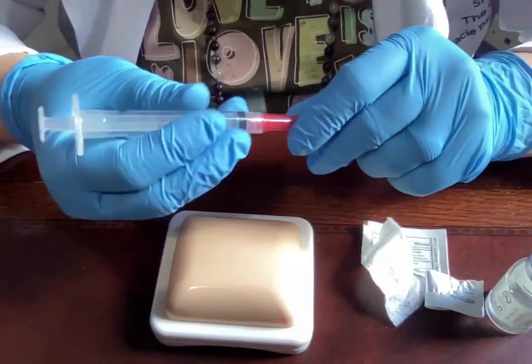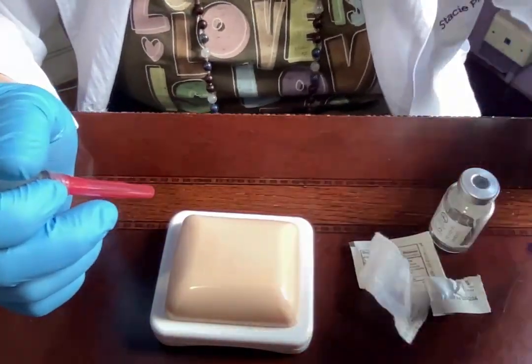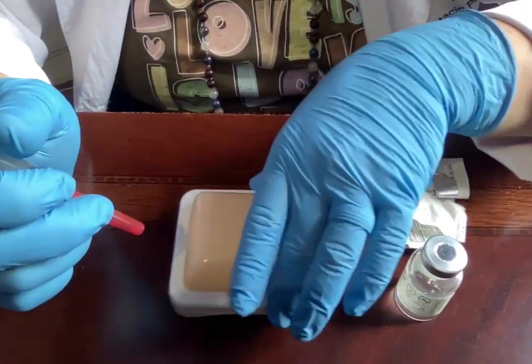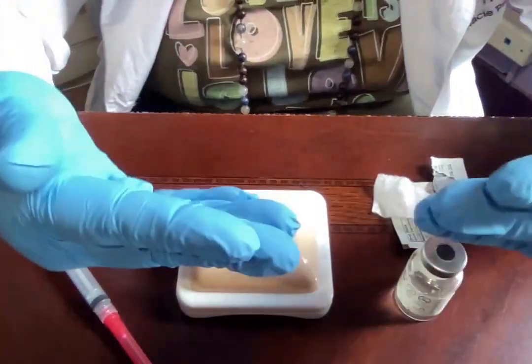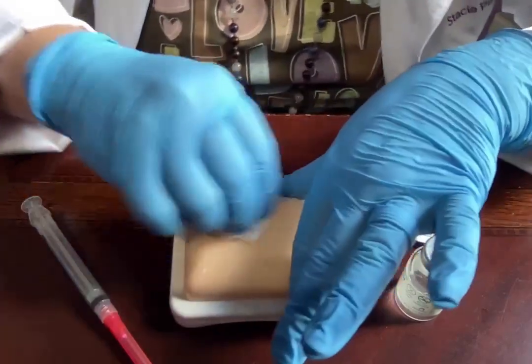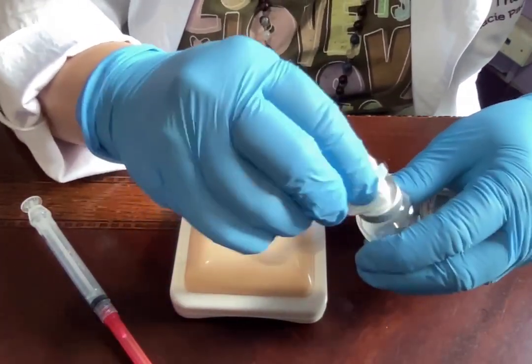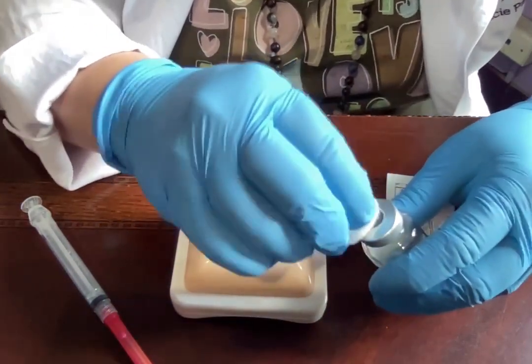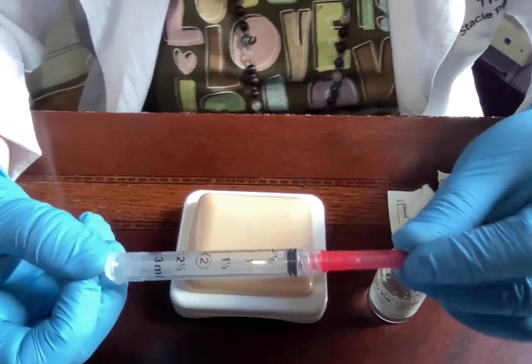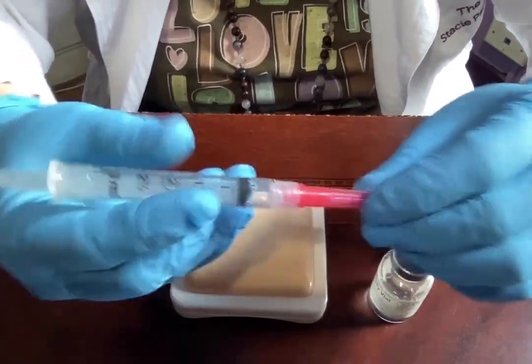That is the subcutaneous injection technique. Let's run through it faster. Gather all supplies — this time we'll leave the cap off the vial since this is a repeat injection. You have your medication, alcohol pad, injection site, needle and syringe, and you've washed your hands with soap and water for 20 seconds. Good to go.